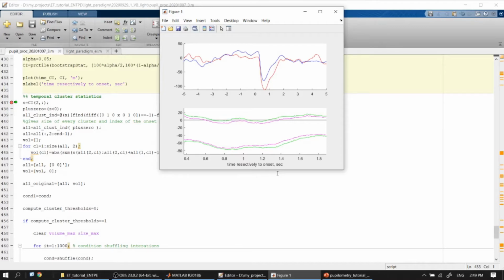But how can we say if in general it is significant or not? We don't do any correction here, and we have a huge number of repeated measures. So it can be entirely spontaneous and not related to any real data. It can be false positive.